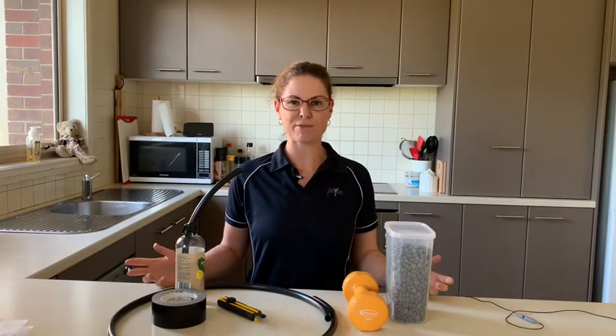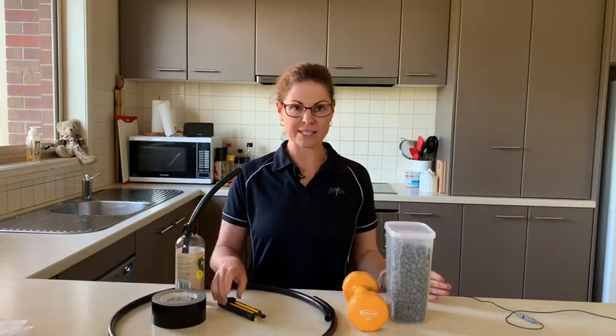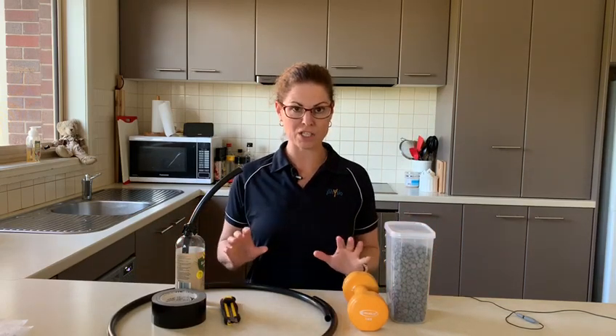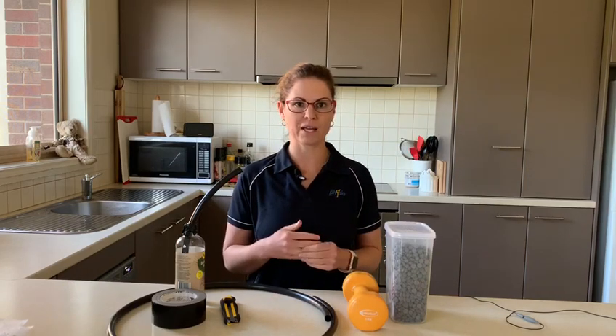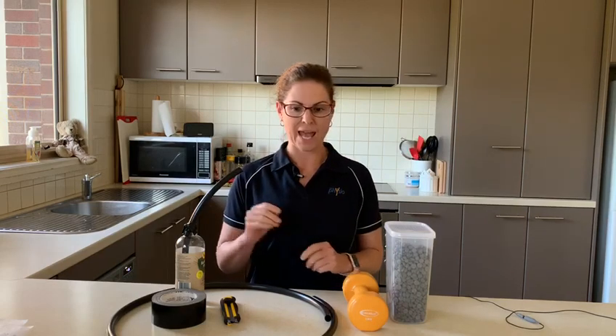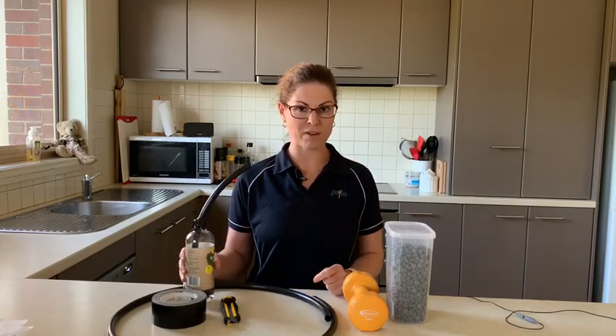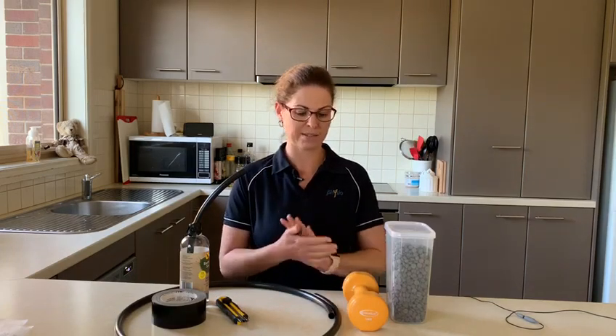Hi everyone, welcome to Saturday morning in my place. I'm a physiotherapist in Ballarat, and I recently was telling a patient about how to set this all up to keep their lungs in optimal shape, given the fact that we're facing a lung crisis with the coronavirus. I also made bubble PEP devices for all my family at that point in time, and I thought I might as well share it with you guys as well.